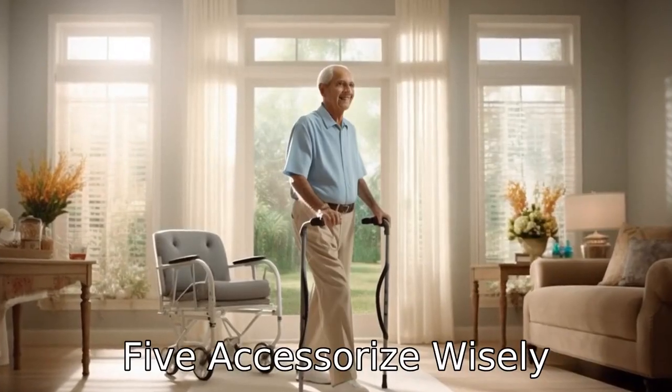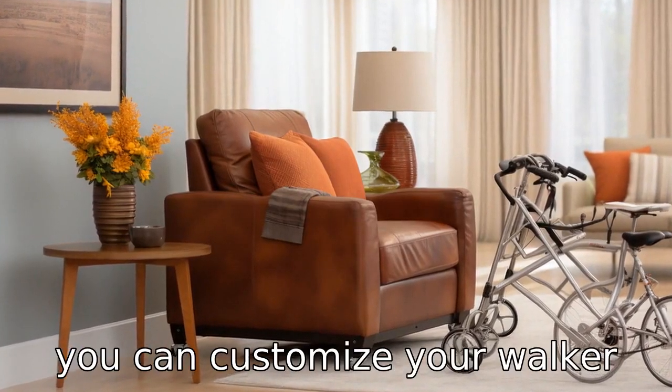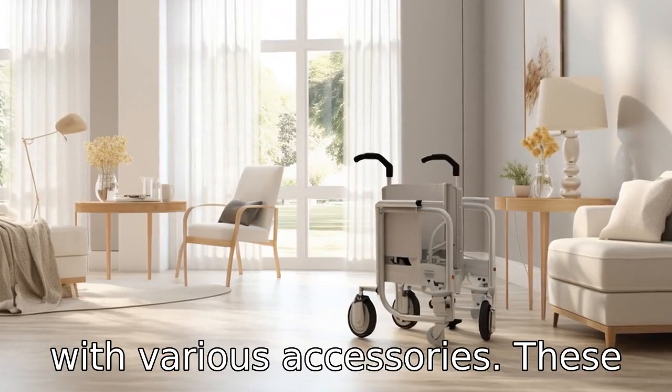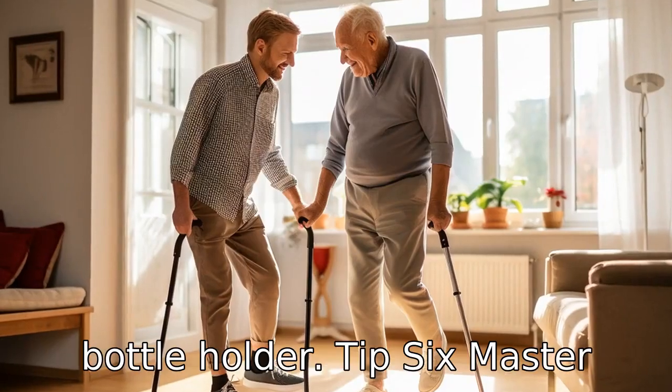Tip 5. Accessorize wisely. Depending on the senior's needs, you can customize your walker with various accessories. These could include a seat, a storage basket, a tray, or even a water bottle holder.